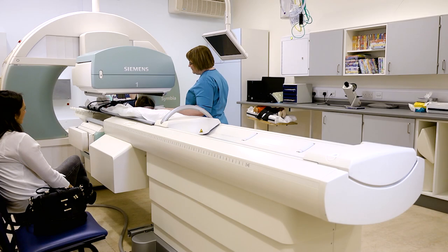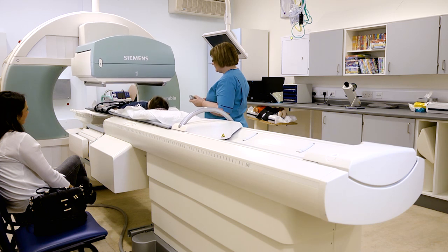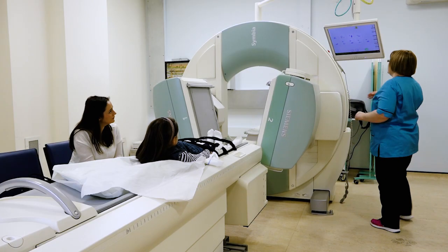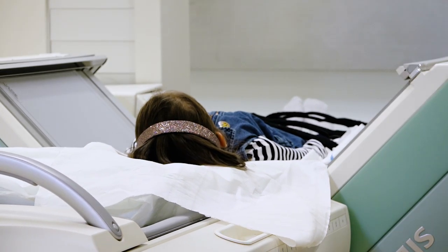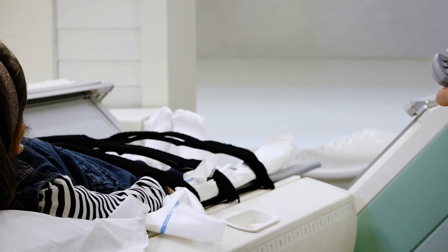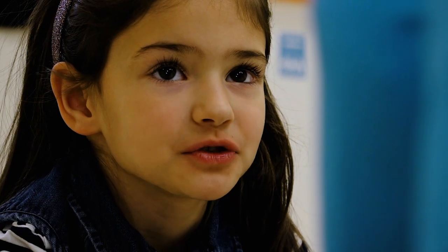Right Scarlett, that's the first scan done — very well done. We're going to move you out and move the camera into a different position now. Then we change the camera and it takes another six to eight minutes. At the end, if the child's very very still, we do what's called a 3D scan and that takes 25 minutes. Thank you for showing me the scan. You're welcome, and I look forward to seeing the film.